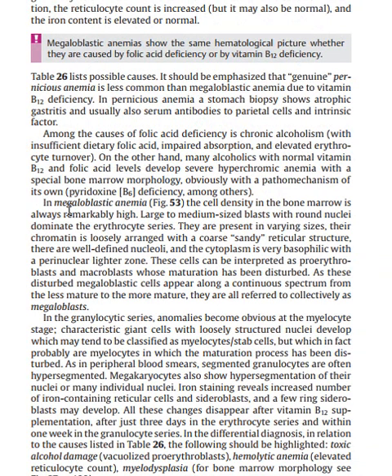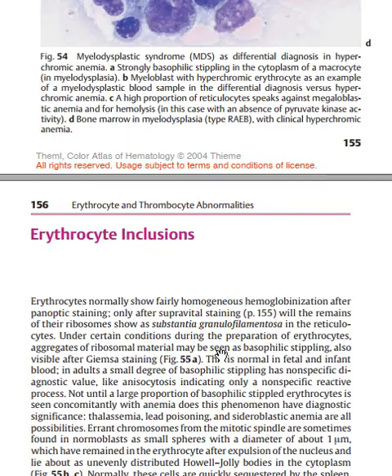So we say here that in megaloblastic anemia, the cell density in the bone marrow is always remarkably high, as you have seen. Large to medium-sized blast cells and round nuclei are going to be visualized. Also, the granulocyte series anomalies become obvious at the myelocyte stage, characterized by giant cells with loosely structured nuclei, which tend to be classified as myelocytes or stab cells, basically. So that is what you visualize in this type of anemia.